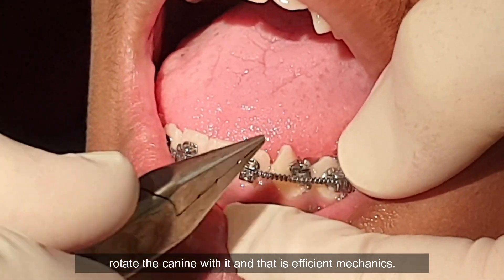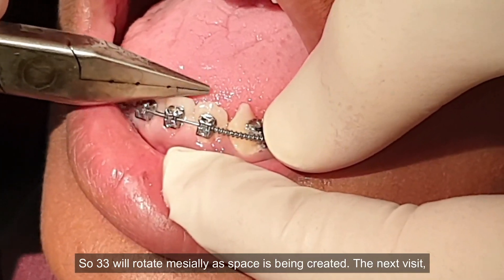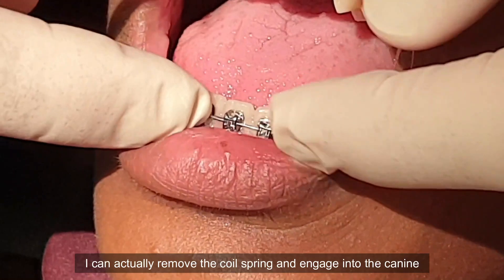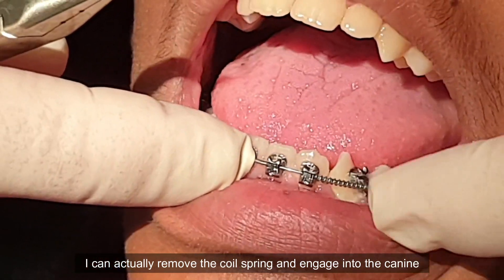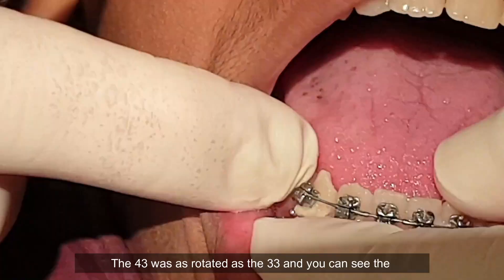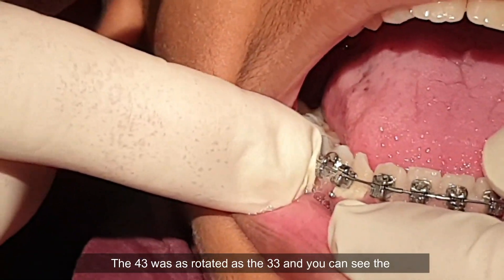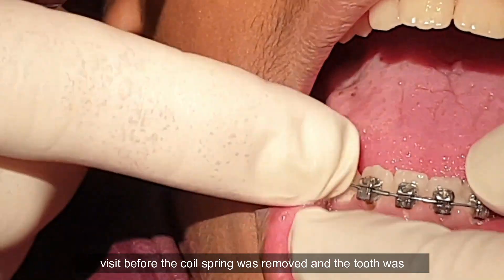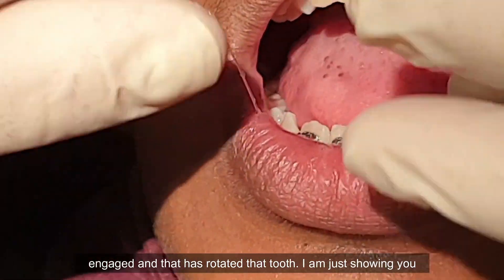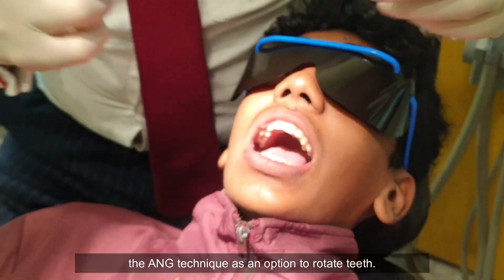So 33 will rotate mesially as space is being created, and on the next visit I can literally remove the coil spring and engage into the canine — and that's what we've done on the tooth on the right side. The 43 was as rotated as the 33, and you can see the visit before the coil spring was removed and the tooth was engaged, and that has rotated that tooth. Just showing you the ANG technique as an option to rotate teeth.